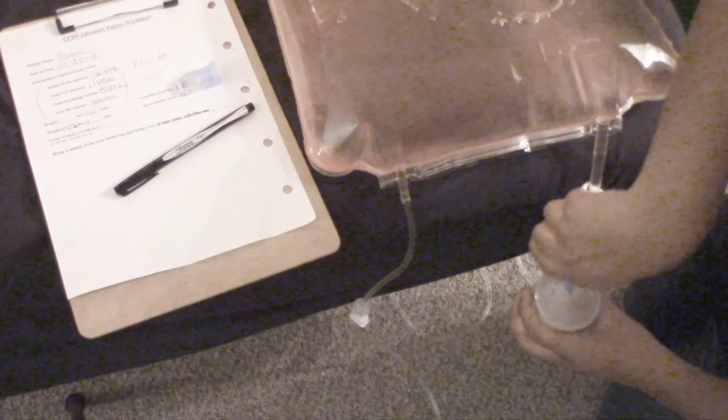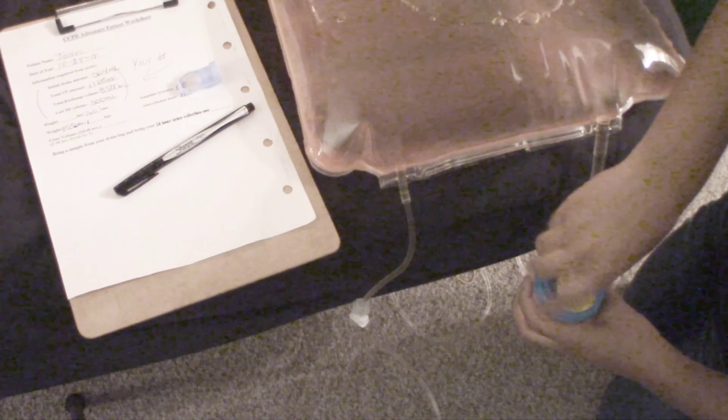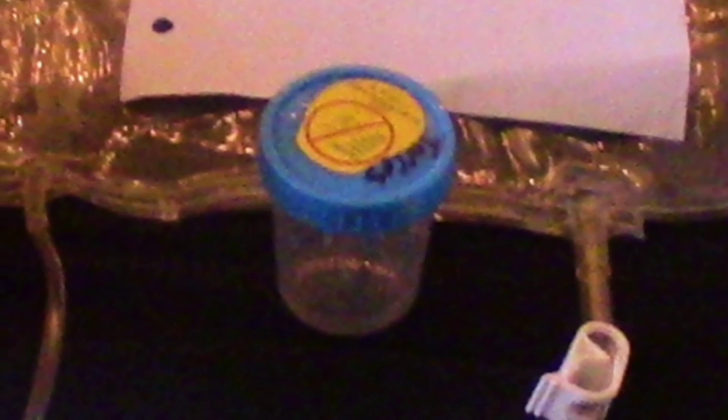We're going to continue draining the drain bag into the sample cup, then close it, and we should be ready to go to our appointment. After all that, you grab the urine container, grab your sample cup that you drained the drain bag into, take the paper with all the information from your treatment, and head to your appointment.